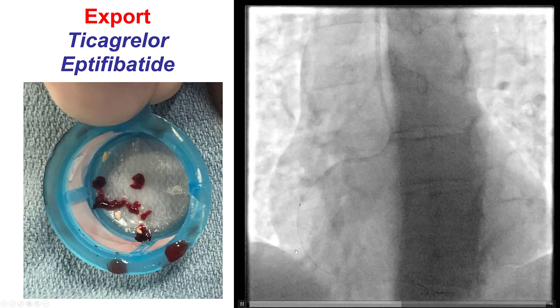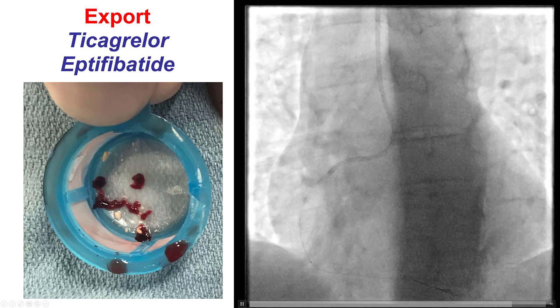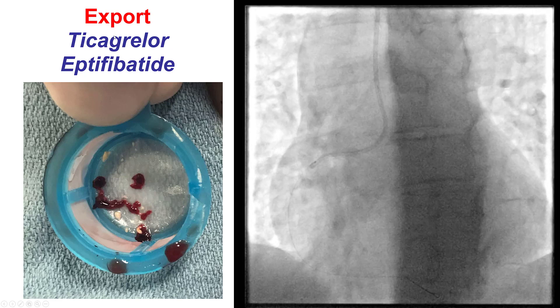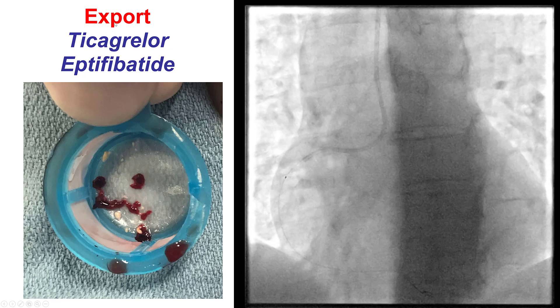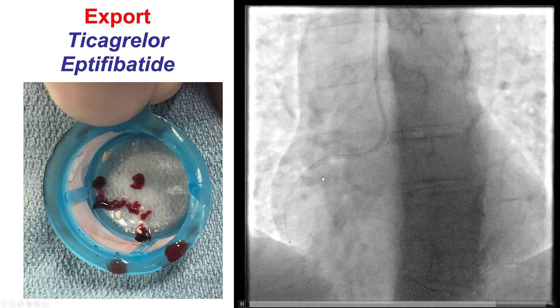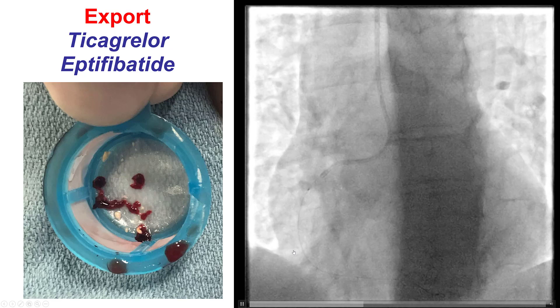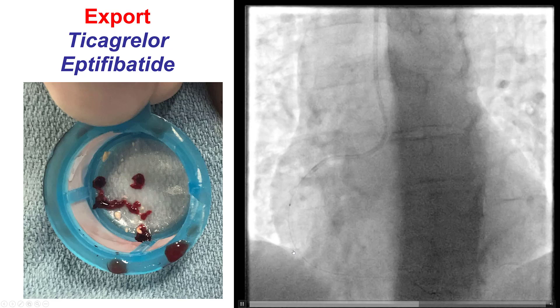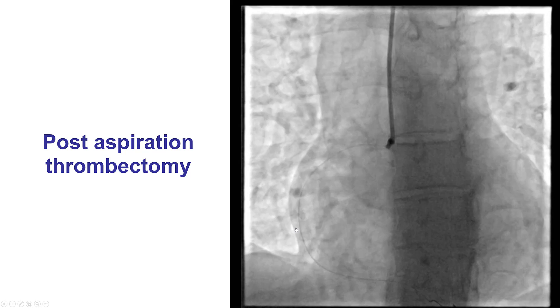We did multiple passes. Another thing that can be done through the Export microcatheter is to advance intracoronary vasodilators such as nicardipine as well as adenosine.